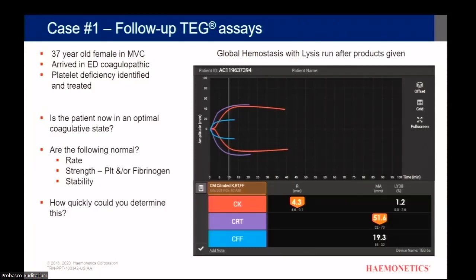So on patients, the 21-year-old that doesn't have a head injury doesn't need the platelet mapping part. But that 8-year-old that falls may not need it either.